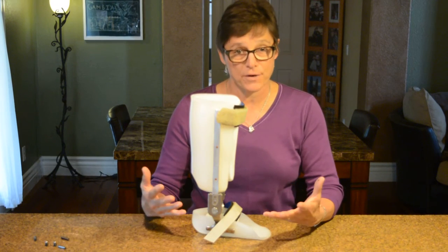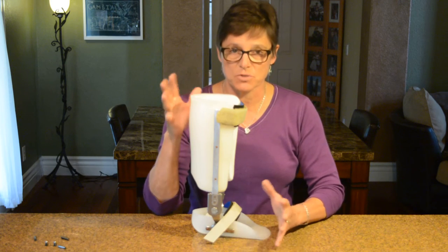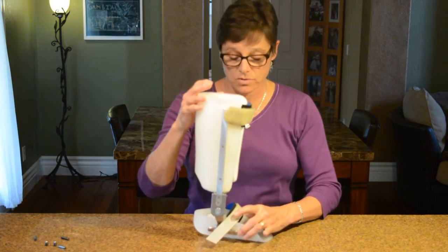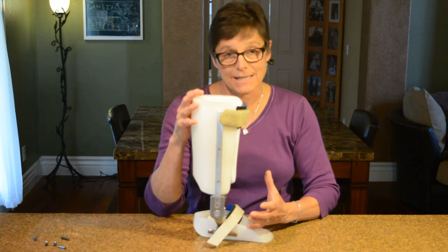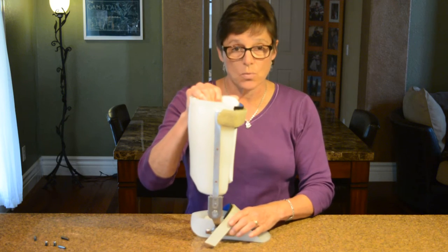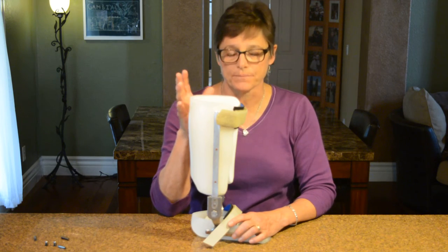Today we're going to talk about AFOs — starting with the double adjustable — and then we'll cover some other AFOs. But first, we need to define some terms. We have open kinetic chain when the leg is in the air and not touching the ground, and then we have closed kinetic chain. Everything we talk about today is going to be in closed kinetic chain, because once the foot is on the ground, the tibia is moving over the foot — not the foot on the tibia. When we're talking orthotics and gait, we're always talking closed kinetic chain.